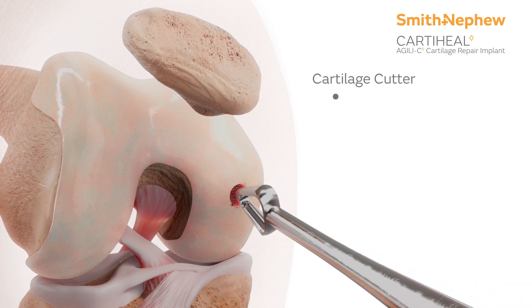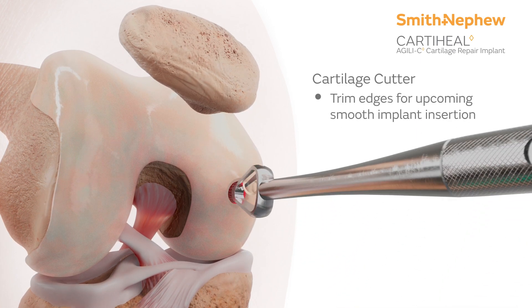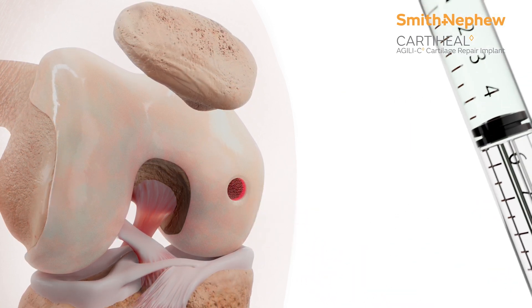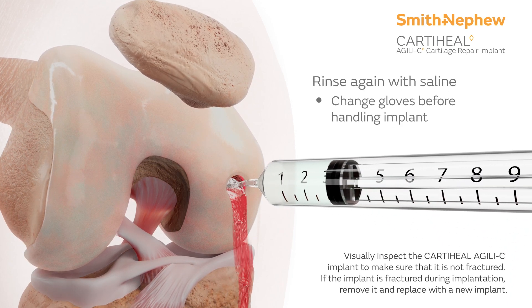Trim the peripheral cartilage using the cartilage cutter or a scalpel to ensure smooth edges and to avoid soft tissue entrapment during implant insertion. Complete a final rinse with saline and change gloves prior to handling the implant.